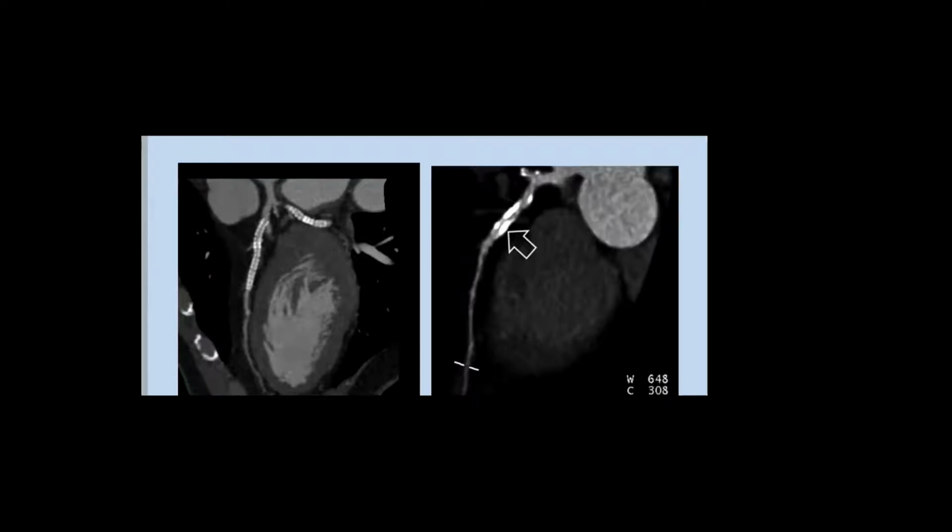Okay, so that's why we have to be so skeptical in doing CTA for patients with calcium more than, let's say, 1,000. Sometimes they don't go for it because the diagnostic accuracy will be so low. And in stents, it's a problem. But the problem with the stent can be manipulated by reconstruction in special ways. But again, the stent itself has a lot to do with the image quality. So the larger the stent, the better, because if it's small, the volume averaging and blooming artifact will be more.